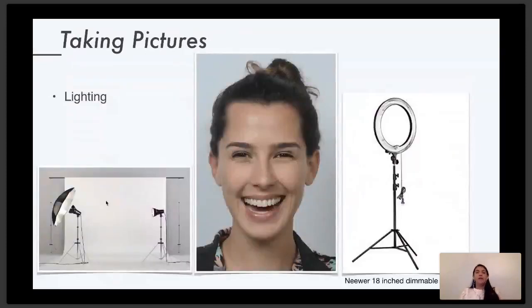Lighting is very important in order to see the details intraorally, okay? So good lighting is a must. It's a requirement. I'm going to add it to the other requirements that we saw at the beginning, because if you don't have good lighting, it's going to look very shadowy inside of the patient's mouth, and you're not going to see all of the details, okay?